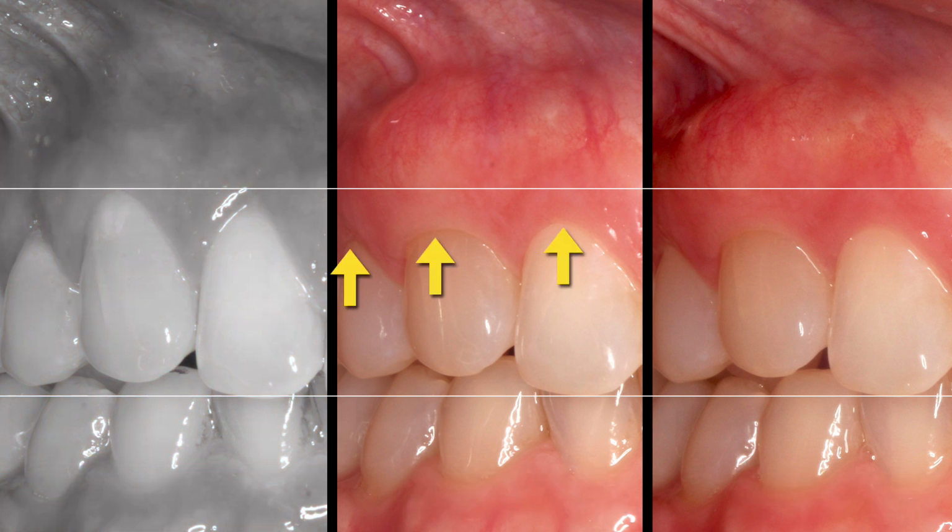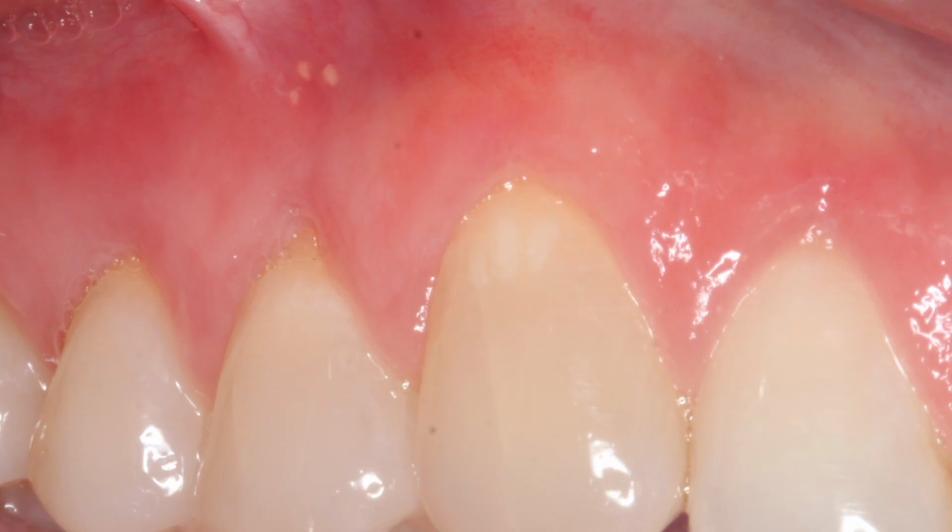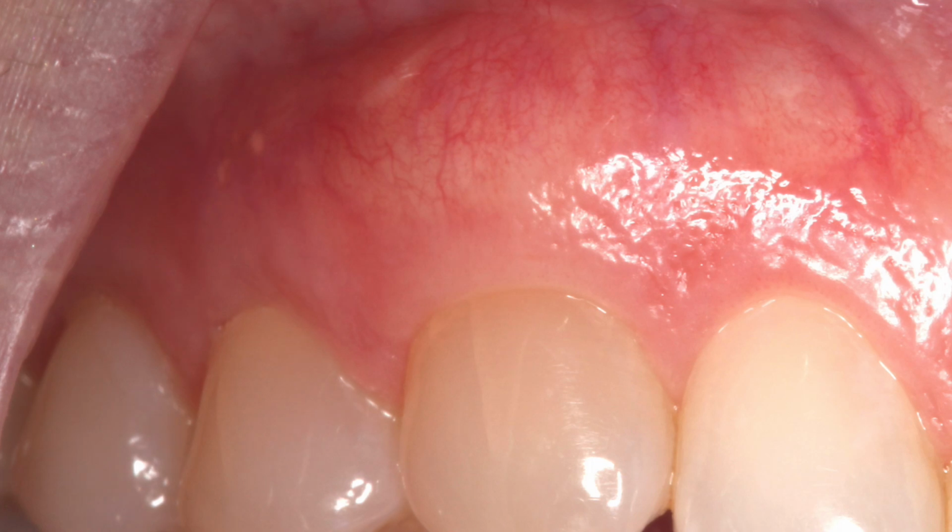All of the new tissue that's formed here isn't just the soft tissue. Given enough time, new bone will grow into the area, and research has shown that extensively. So here it is again, the before, with the root surface exposed, tissue thinning, tissue disappearing, and how we are able to turn it around to bring the bulk of the tissue back to make it as strong as possible.